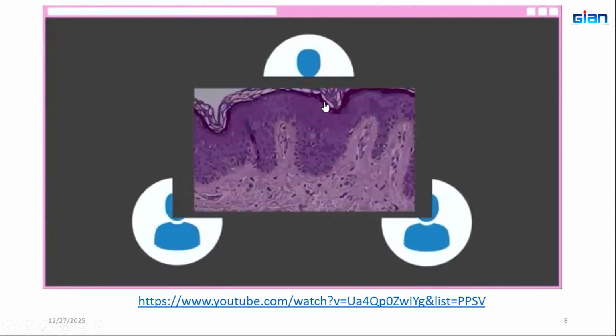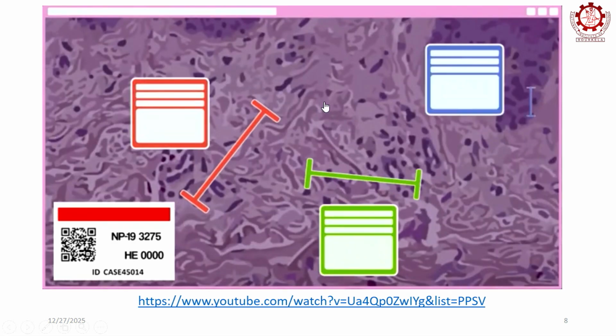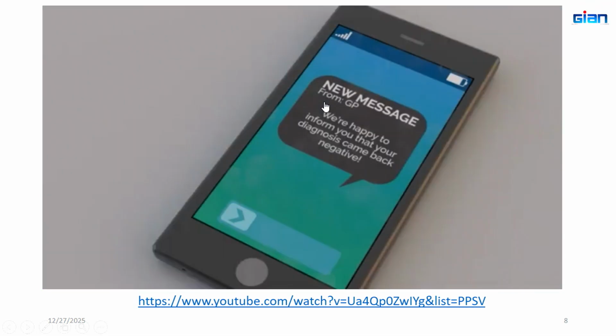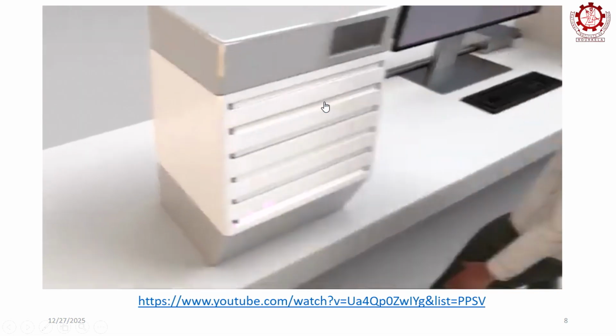The pathologists can also examine the sample in great detail and make notes and highlight areas, aiding the communication between pathologists. Going digital can significantly reduce the diagnosis time. This means that patients can get their results much quicker than traditional methods and can begin treatment much earlier if necessary. So now, let's talk about the possibilities that digital pathology can support.